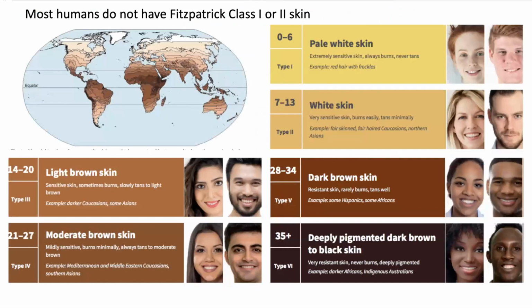That was a very important additional factor which we wanted to consider. And in the lab at the time, we were simply using the Fitzpatrick scale for want of anything better, and really based on ignorance. We didn't realize that perhaps Fitzpatrick was not the best assessment. And I look forward to learning more about what we know about these issues and incorporating them into the future studies that we do.